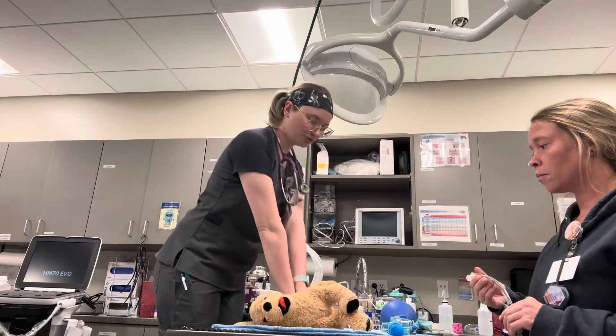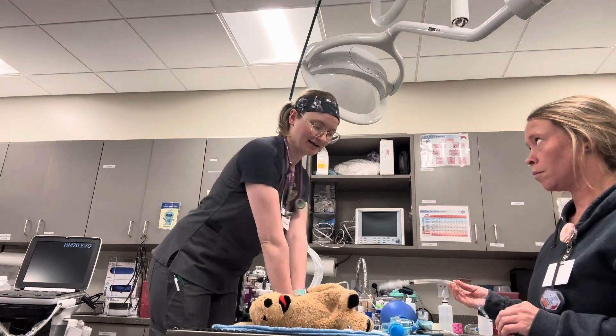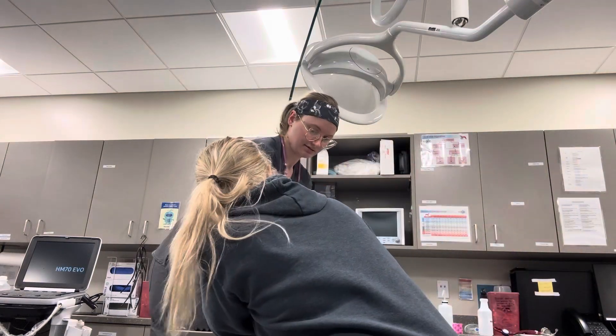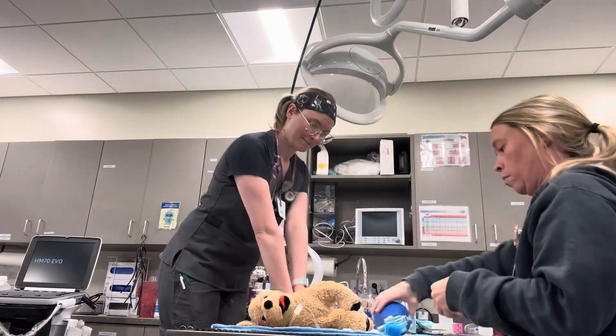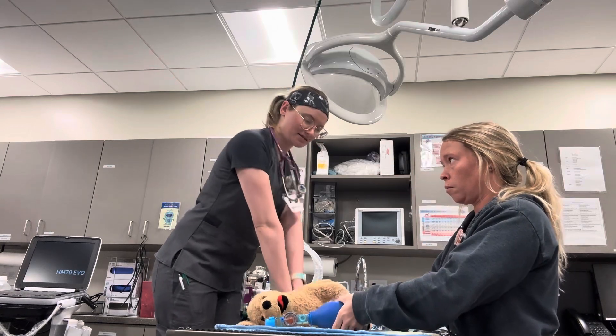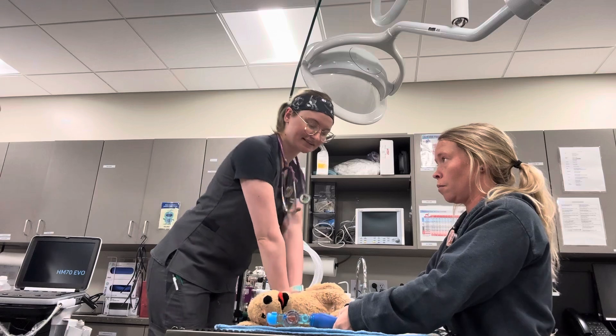I'm going to do this for two minutes and then switch out. While this is happening, I'm going to have my co-worker intubate and connect the ambu bag. Give six breaths — 10 breaths a minute, so a breath every six seconds.